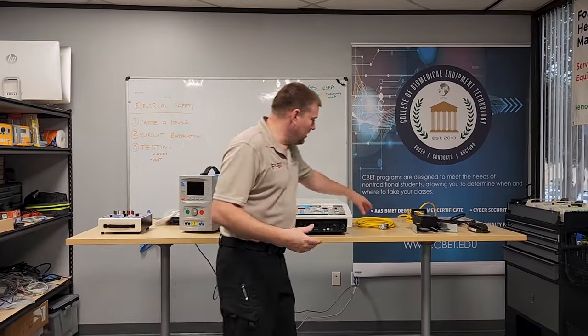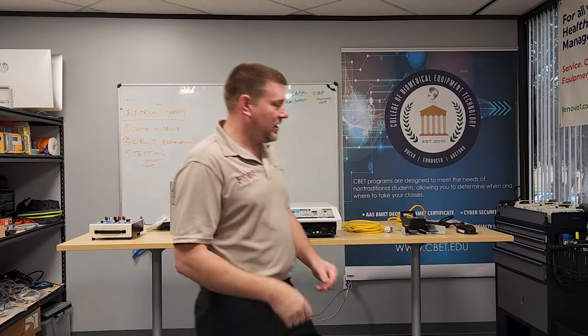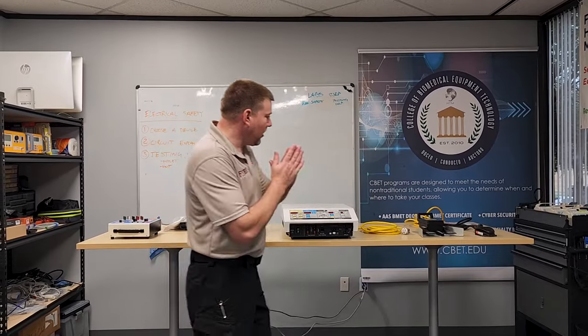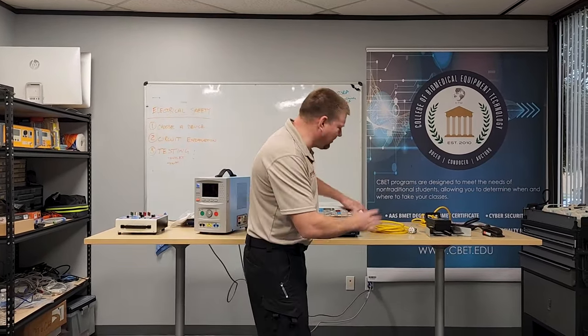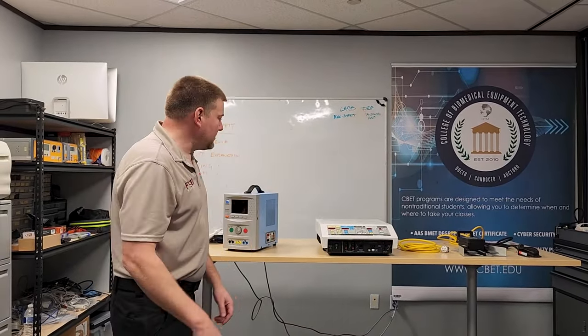Everything associated with this device needs to be quarantined. I have the ESU — it's hardwired, so this is the original power cord. If you have a non-hardwired power cable, you need to make sure you acquire the power cord; it's an essential piece of the investigation. I also have a monopolar and a bipolar foot control. You want the foot controls because fluid intrusion or a short in the foot control could cause the ESU to activate even when the doctor thinks he's not activating it. Older analog foot controls are susceptible to this; newer digital ones are not.